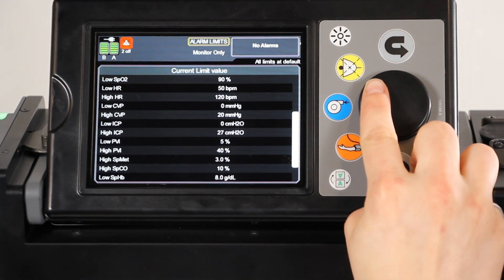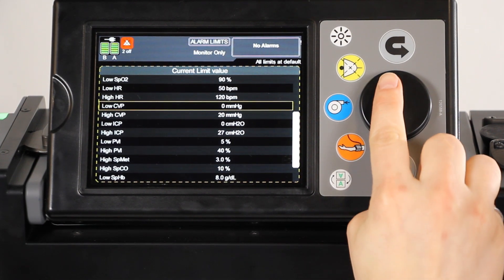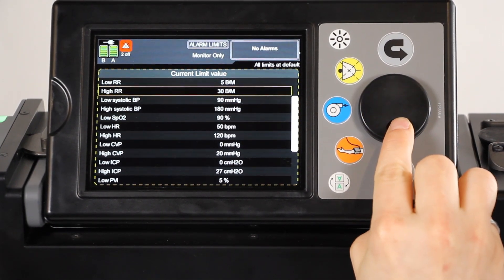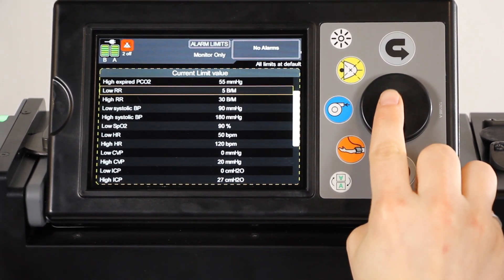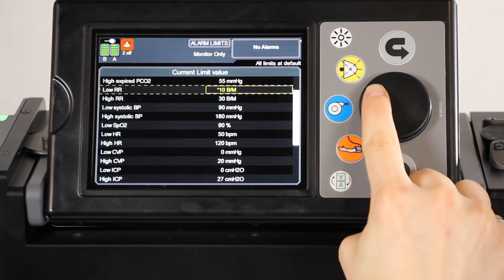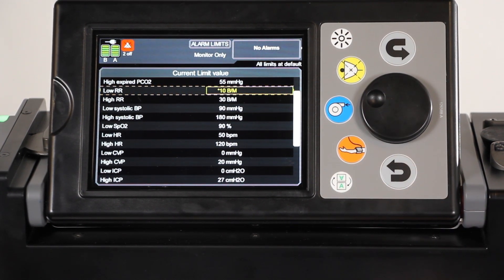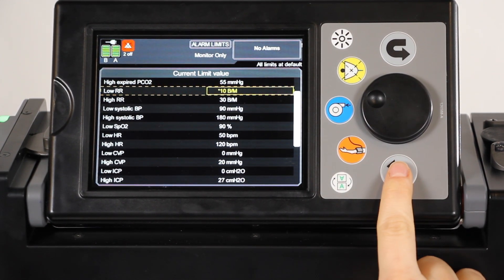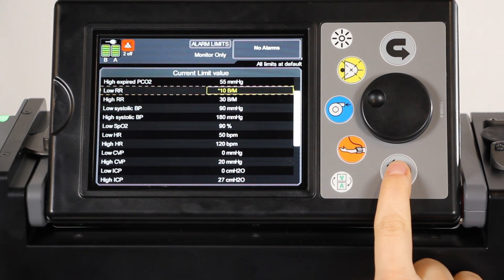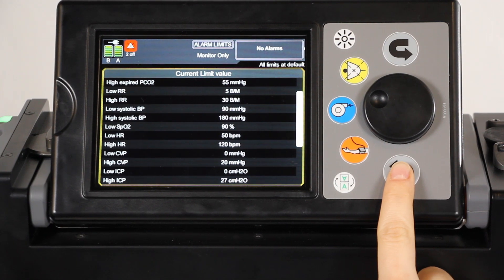Using the jog wheel, navigate to the current limit value list and press the jog wheel to activate it. The list is scrollable once it is activated. To modify a limit, navigate to the limit you would like to change, press the jog wheel to activate the limit, then rotate the wheel to select a value. Press the jog wheel again to confirm a new value. The back button can be used to abandon an actively selected limit without changing the value.